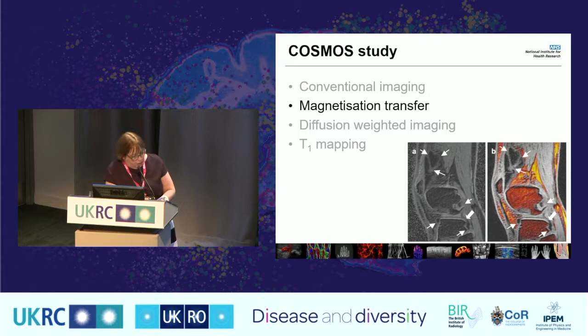Again, this is a magnetization transfer image here, and we can see the synovitis quite nicely up here, but we can't really see what's happening here because it's a pretty grey image, and we've kind of lost all those contrasts between our tissues. But again, if we put fat onto our image, we get better delineation. So we can see better delineation between the muscles and synovitis, which has always been an issue. But unfortunately, still around the back here, we can't see what's happening.